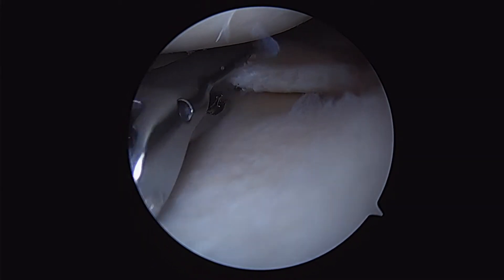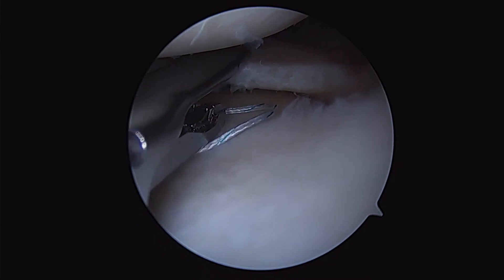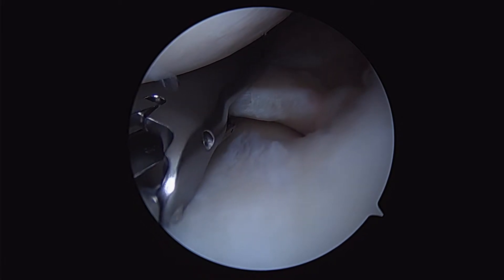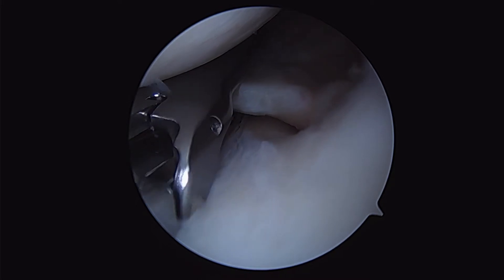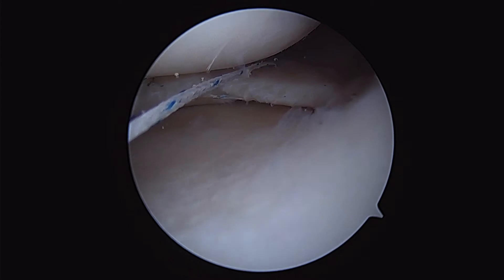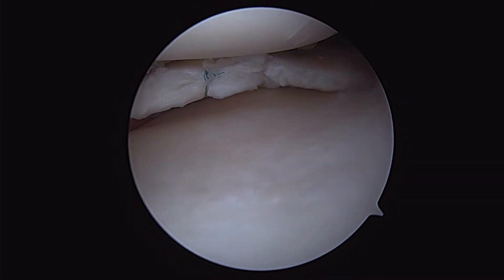Here we've already passed our second vertical mattress suture. Now we're going to make a rip-stop stitch, which means we're going to pass suture outside those vertical mattress sutures and use those vertical mattress sutures as a point of traction to help us close down the meniscus tear and take some of the pressure off of the suture itself, so that it has less risk of cutting through the meniscus.